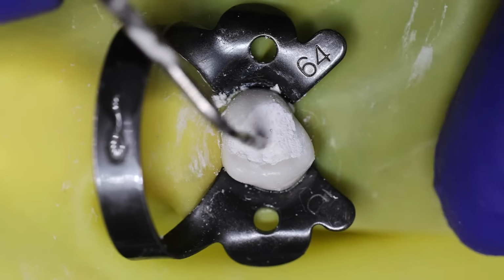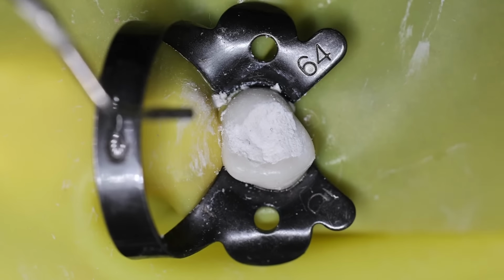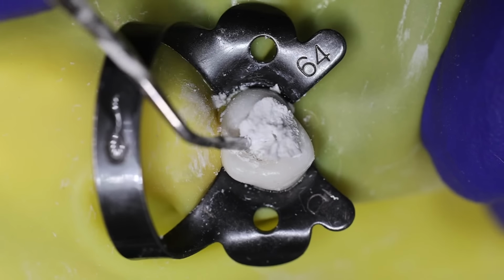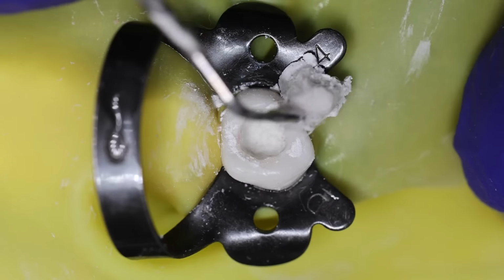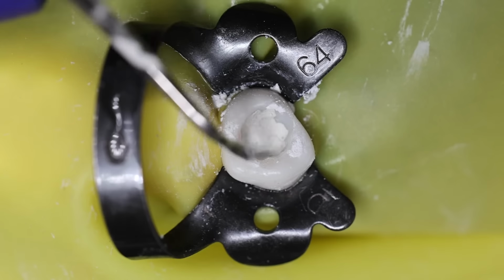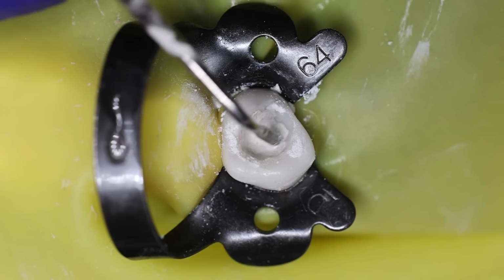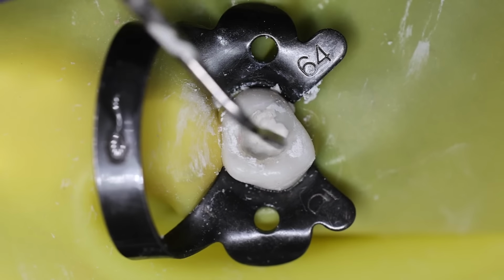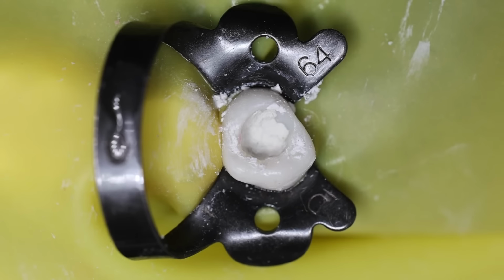Okay, we'll just show how after 48 hours, suppose we have been waiting, then we will remove it. After 48 hours we will remove it, and what we will see is that the MTA underneath is set. This is the initial set, but after final set this would be harder. So now you can prefer any type of restoration that you want to do. For example, we want to do composite restoration.